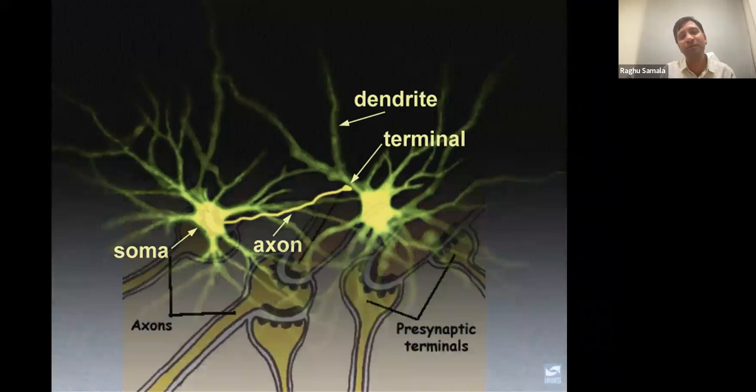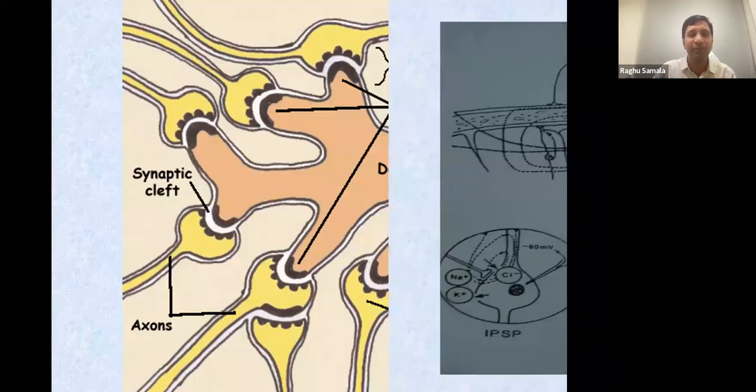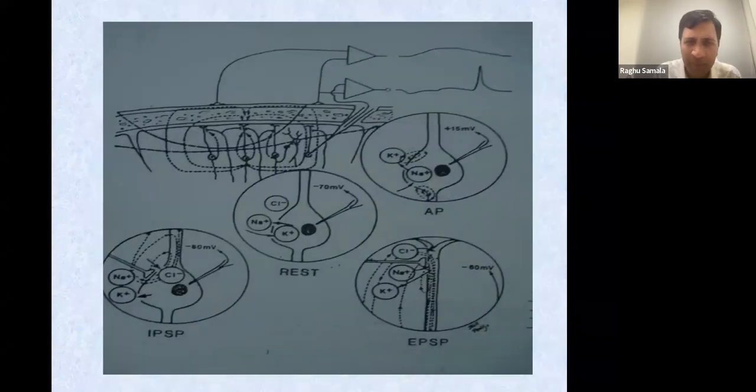Can we record from one synapse? It is not possible. It is a collective activity from multiple synapses. So what you are recording is the postsynaptic potentials, summated from the multiple synapses. But you are not putting the electrode directly on the synapse. You are recording from the scalp. So there are a lot of barriers between where the activity is actually generated and where you are recording.